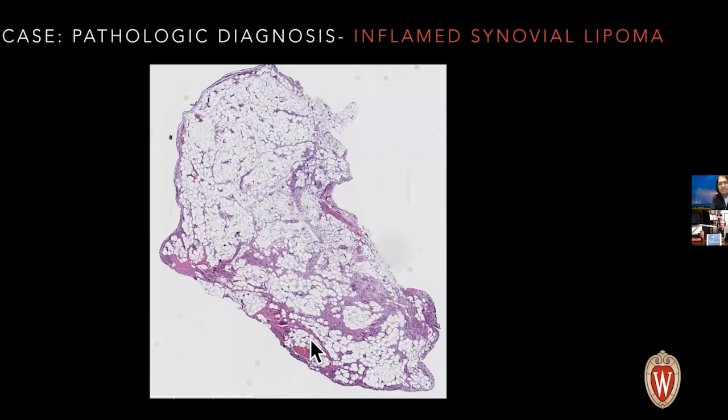The surgeon fortunately sent some tissue to pathology. And so interestingly, this is not a nerve. And so this is why I'm interested in what the scan is showing. It's showing lots of inflammatory cells in what was called a synovial lipoma. So she had, for some reason, a stalk with a big fat ball attached to it, and it was being whipped around between the cruciate ligaments in that part of the knee. And she probably was born with this, or over time developed it, and it got bigger and bigger and very irritated.